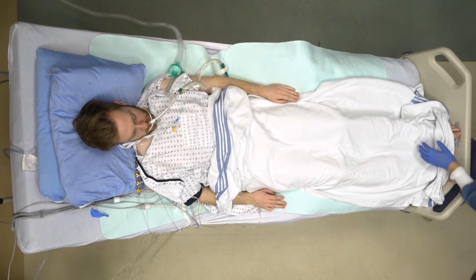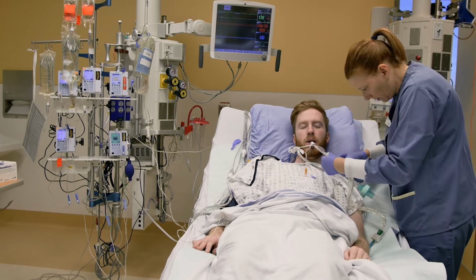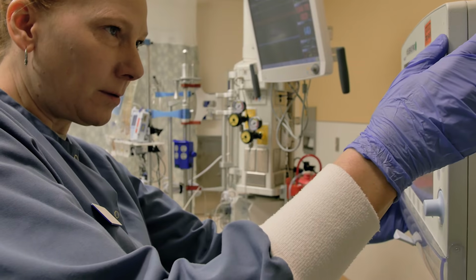Many patients in the ICU require intubation and mechanical ventilation due to their inability to maintain airway, oxygenation or ventilation issues, or both. Therefore, part of your assessment will be to assess the patient's airway and review the ventilator settings.